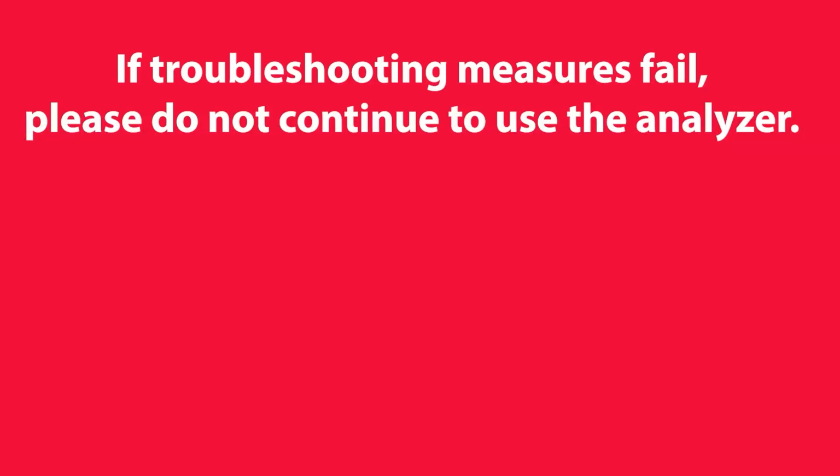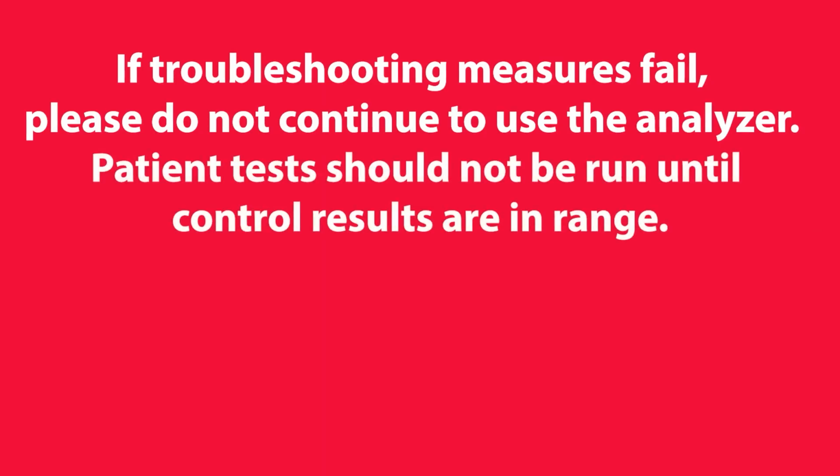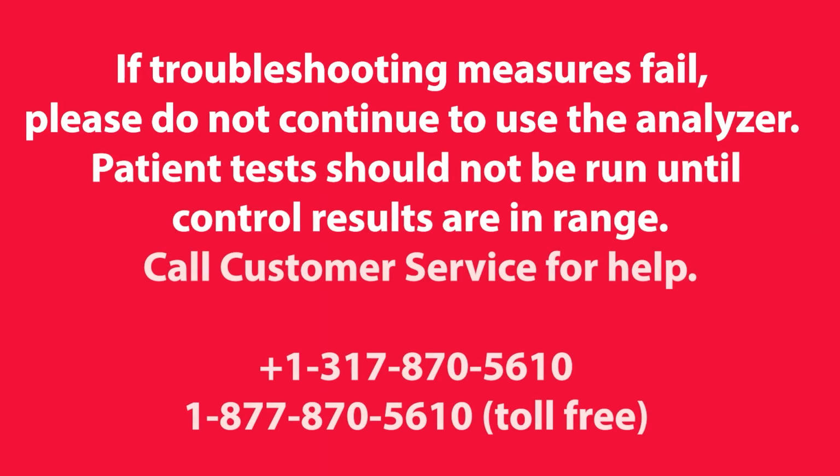If troubleshooting measures fail, please do not continue to use the analyzer. Patient tests should not be run until control results are in range. Call customer service for help.